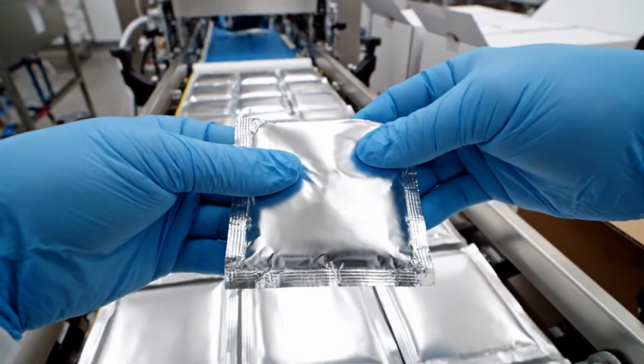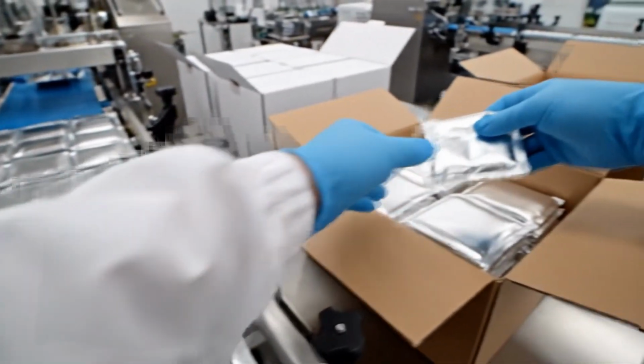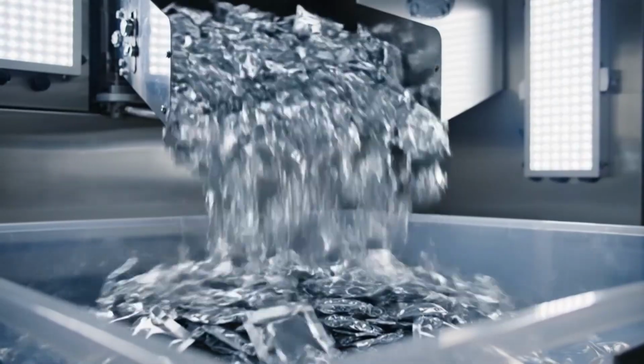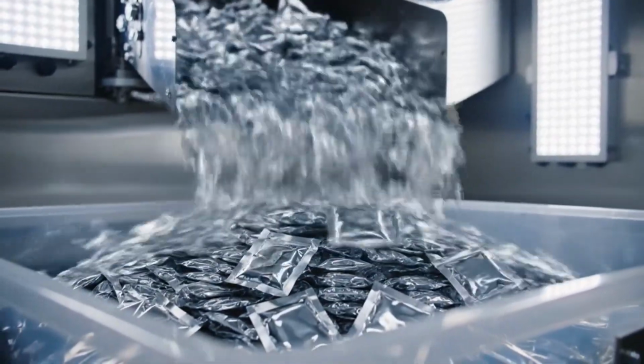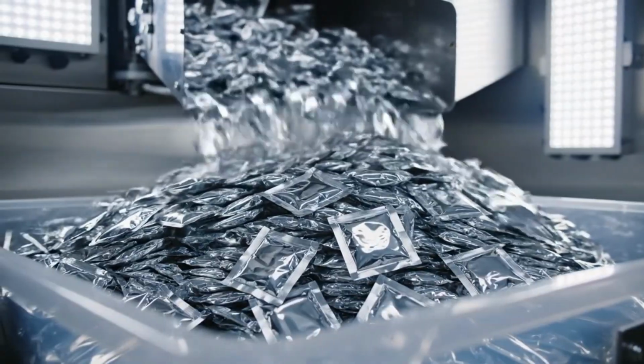That air pocket inside the foil acts as a shock absorber, protecting the condom during shipping. Phase 4 is complete. Each unit is now a finished, sterile, and lubricated product, ready for the consumer.